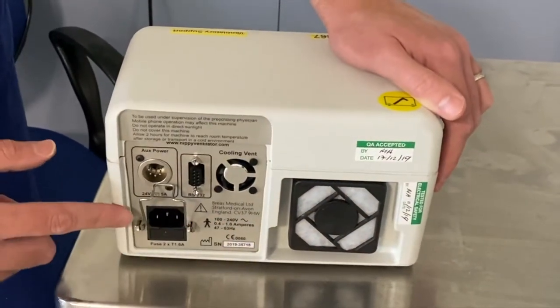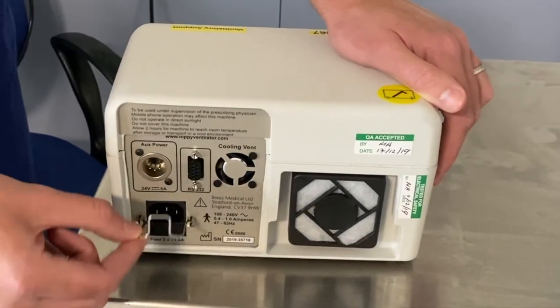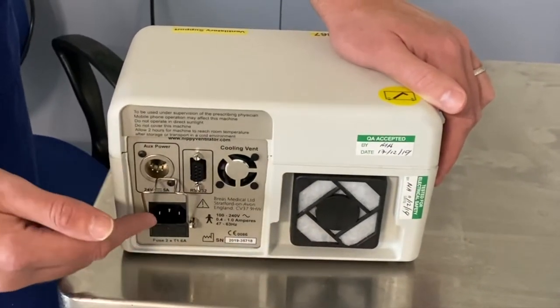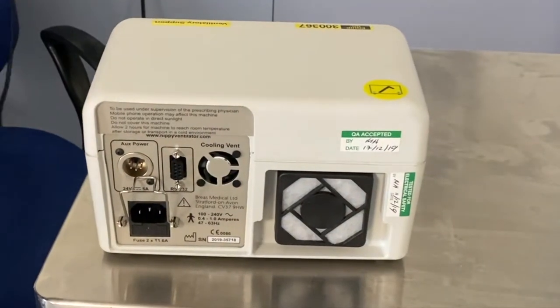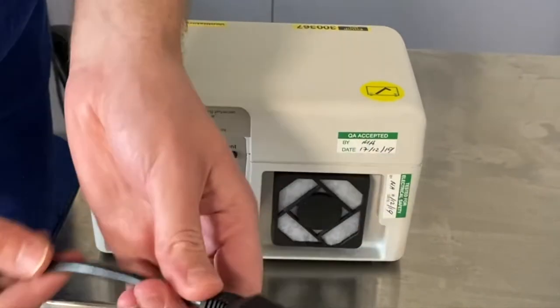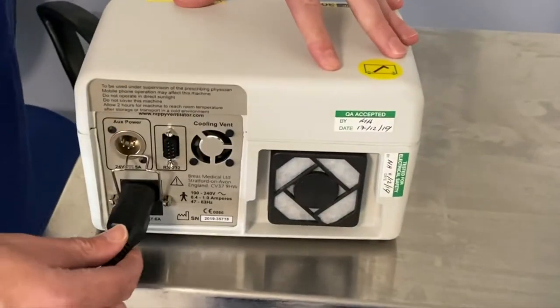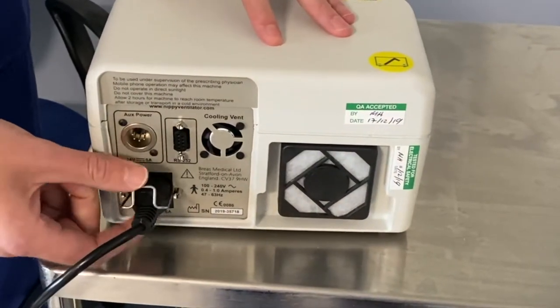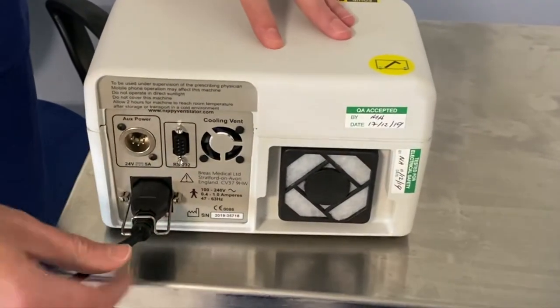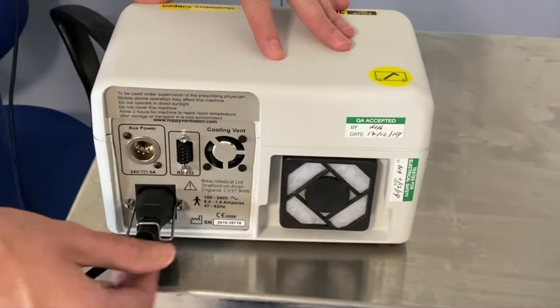The next thing to be aware of is the power cable socket. You can see there's a little bar that comes down here as well. The power cable is a standard three-pin plug. It pushes into place like so, and this bar then comes down and locks it in place. It's really important to keep that in place because it will stop the power cable from coming out accidentally.